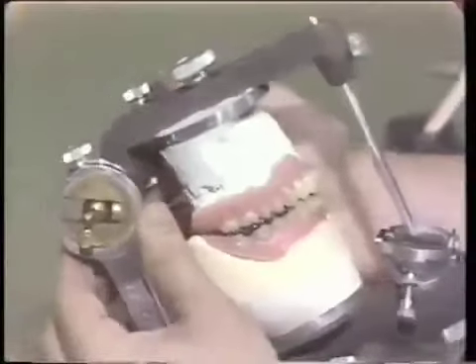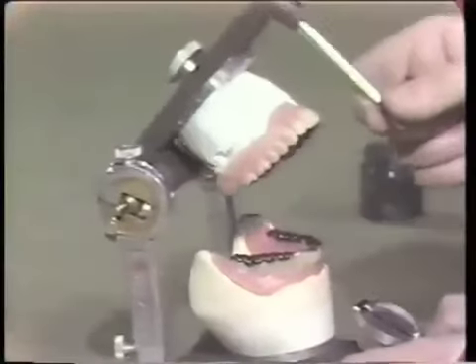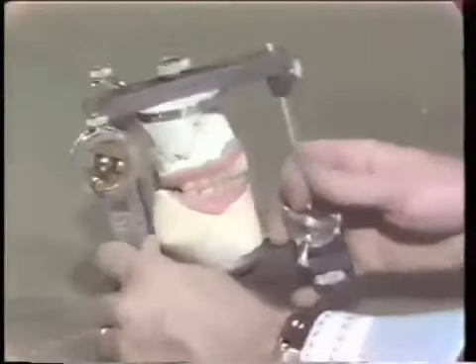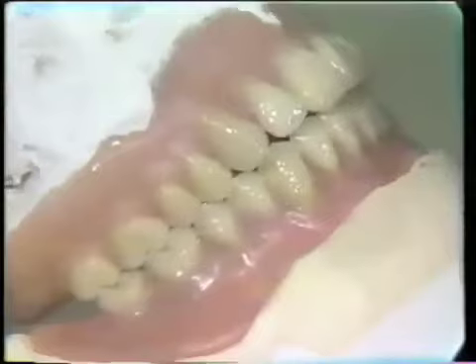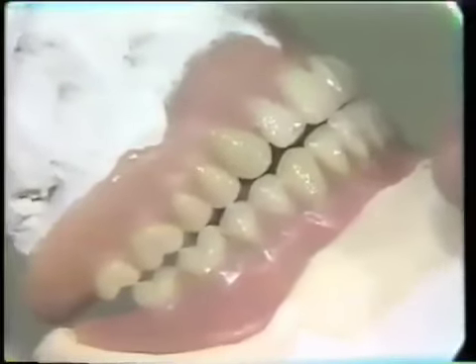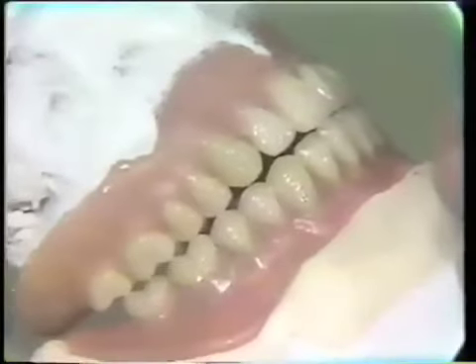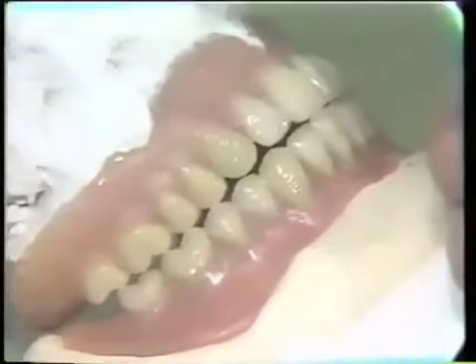That's plenty. This material is water soluble, so at this time I will remove the carborundum material from the teeth and we'll take one closer look at the completely adjusted case. The milling paste has been removed simply by water and a brush. We now have a smoother excursion — as I move it into working you can see how nicely the teeth come through, and there is balance on the other side of the arch. In protrusive, going straight back, the cusp doesn't touch but every other cusp tip does in this case. Not all of you will have every other cusp tip touching, but we want to make sure at least two or three of them do in the posterior part of the mouth. I have incisor contact and many contacts in the posterior part, so I am happy with the protrusive contacts.